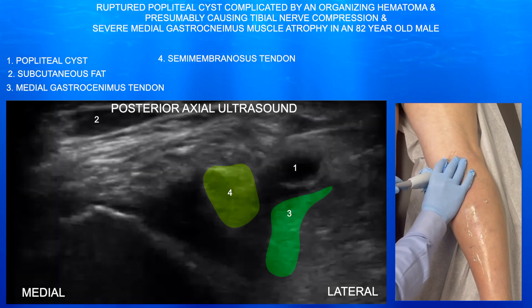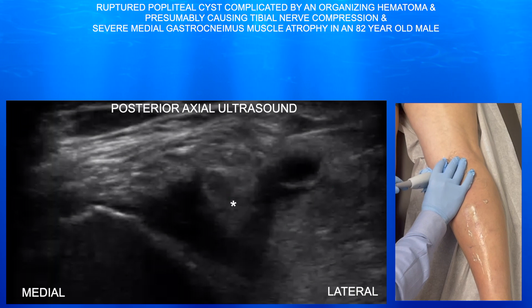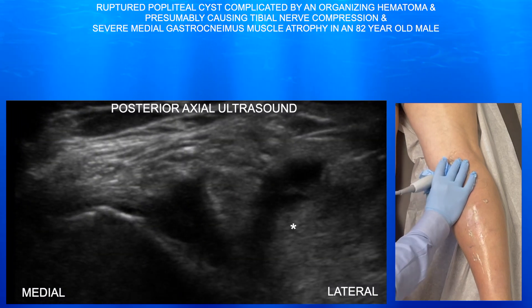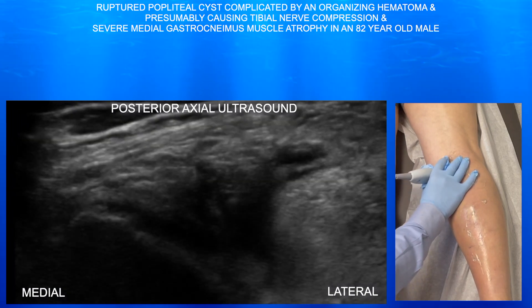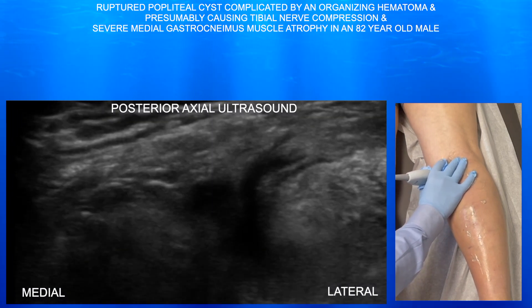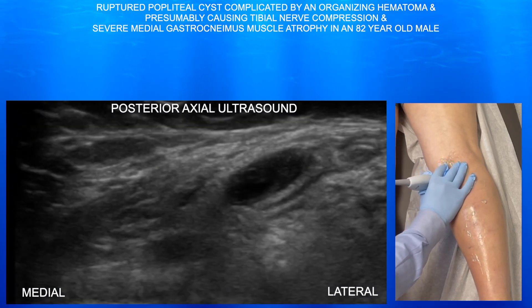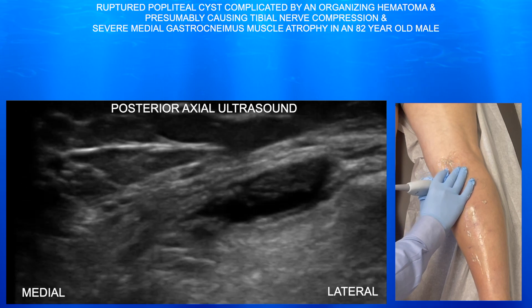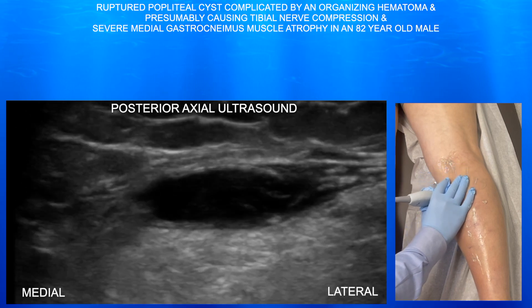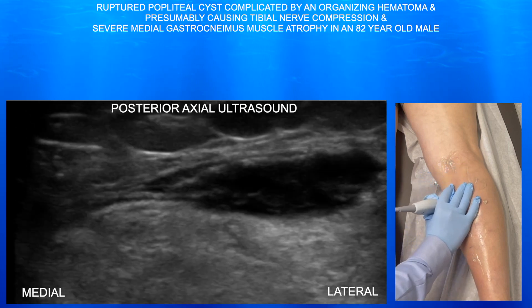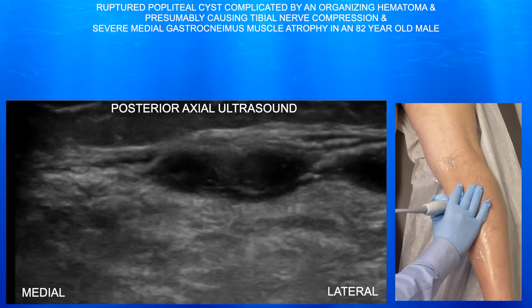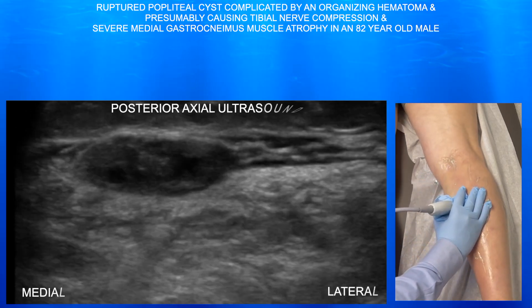Here you can see well the semimembranosus tendon and the medial gastrocnemius tendon essentially at the same time, which is pretty difficult to do. Usually you just get one of them in view at a time secondary to anisotropy.